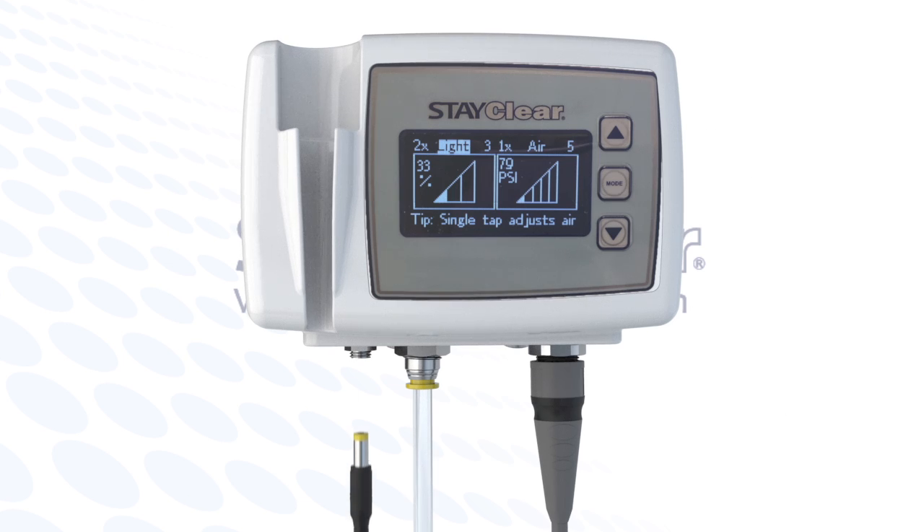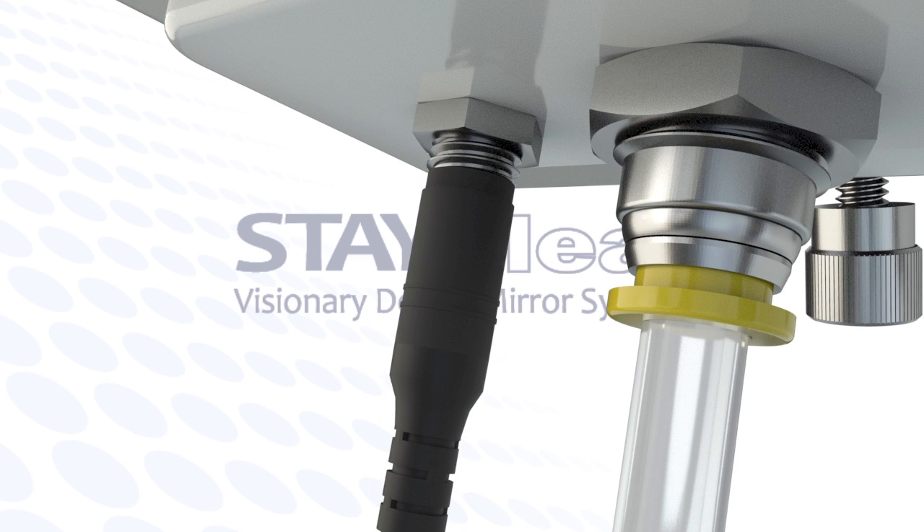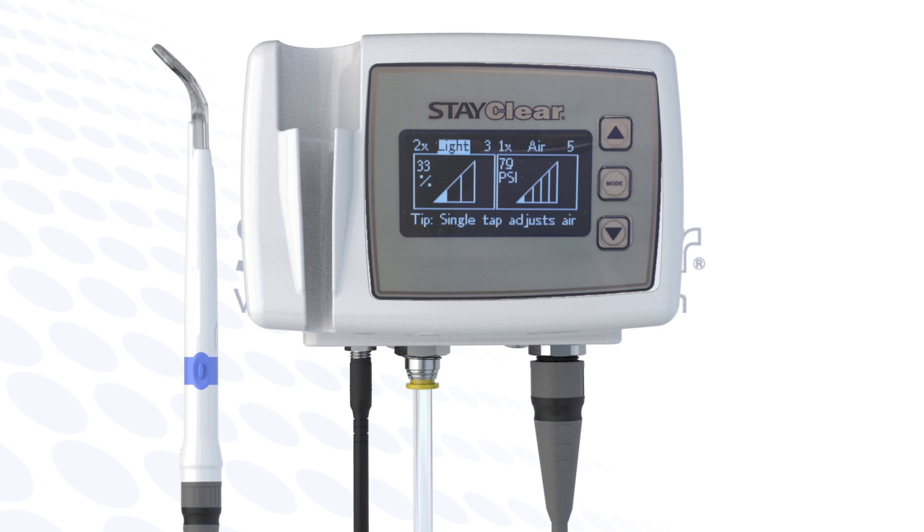Now, insert the power jack cord into the StayClear cradle and insert the silver power adapter lug on the bottom of the cradle. Now, insert the other end of the power cord into a standard power receptacle. Great! You are all set and ready to use StayClear.